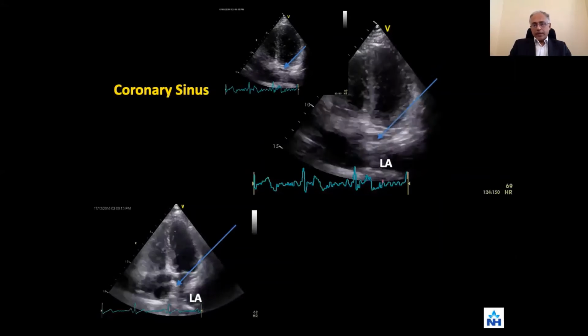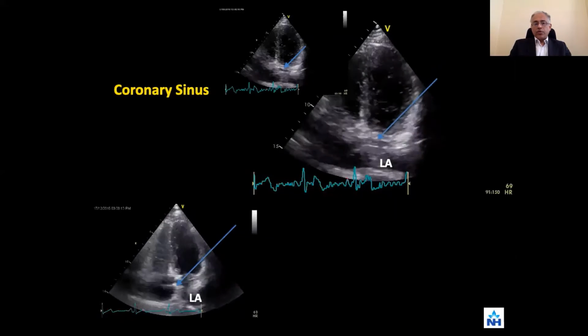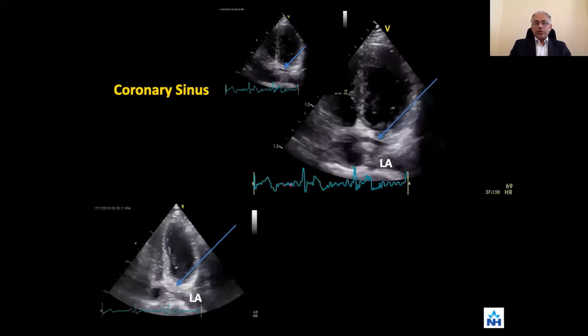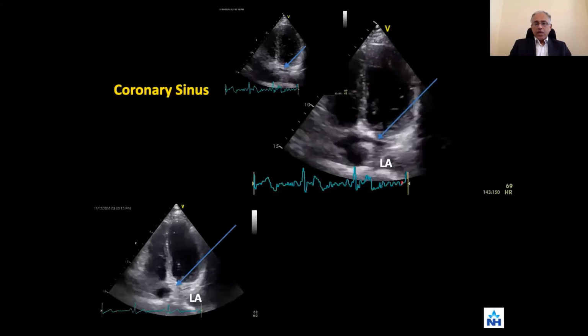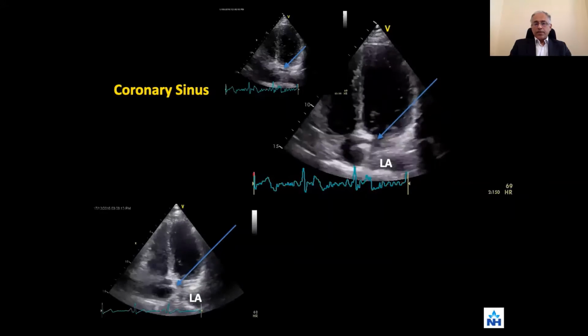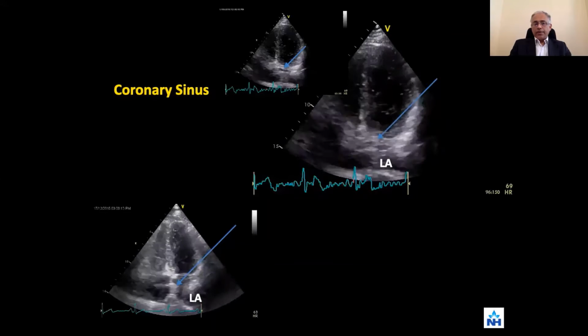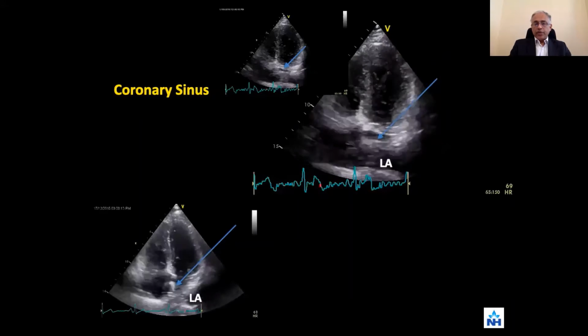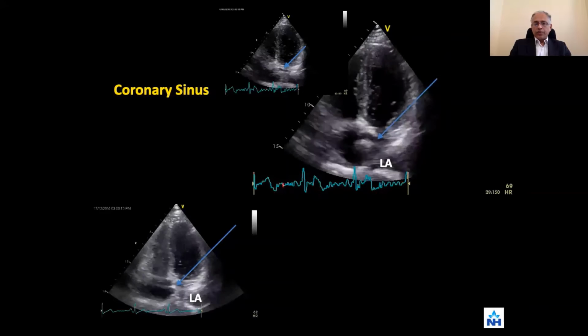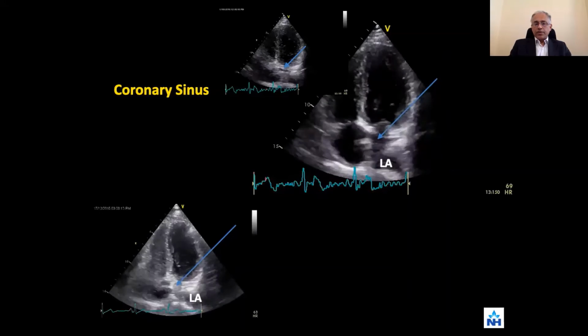Now, coronary sinus, if you continue that anatomy from what you saw in the right atrium, you saw the opening previously. Now I have opened it a little more. You can see that it courses in a transverse fashion as it crosses the atrioventricular ridge, the groove, and then you can see that prominent lucent, translucent area.